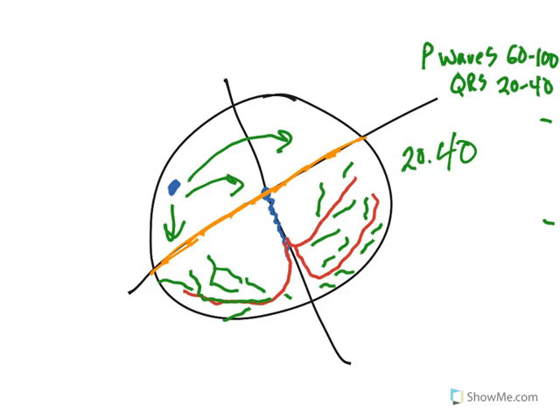But you could also have a high block, which means you're getting firing either from the lower portion of the bundle of His or from the bundle branches. So there is still function in those bundle branches. What you're actually seeing is what almost amounts to normal conduction going through the ventricles, except that the rate is usually slow. The P waves fire off and have no connection to the QRSs. But when the QRS fires, because it actually still goes down those bundle branches, we can still have what looks like a normal QRS complex, okay?